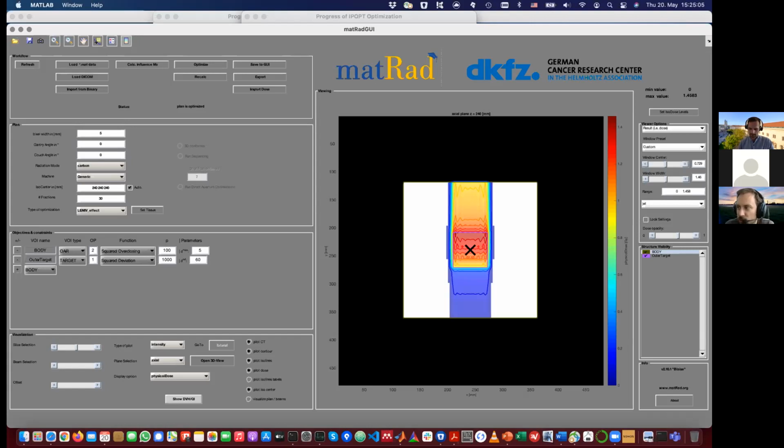So you boost, for example, with carbons the gross tumor that you see, but then you use photons to fractionate better on the mixed tissue, because you know there's some mixture of cancerous tissue and healthy tissue. So you need to find a better balance.